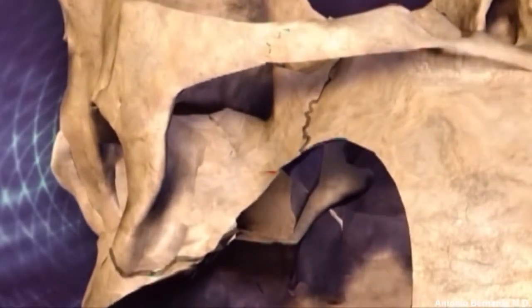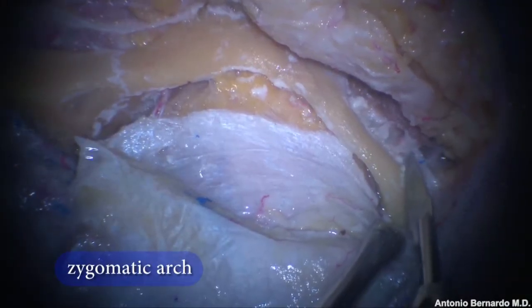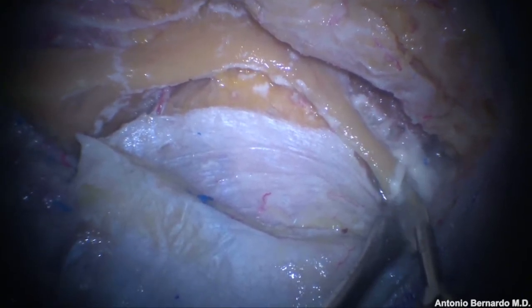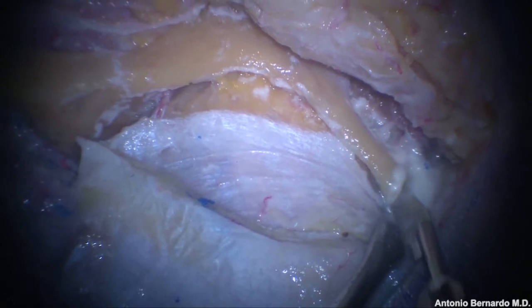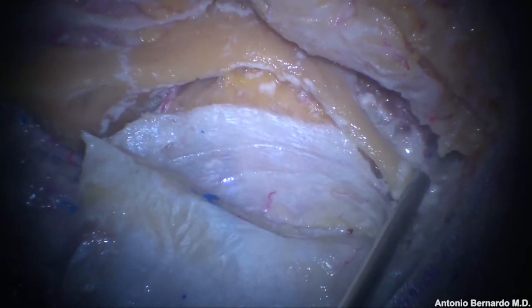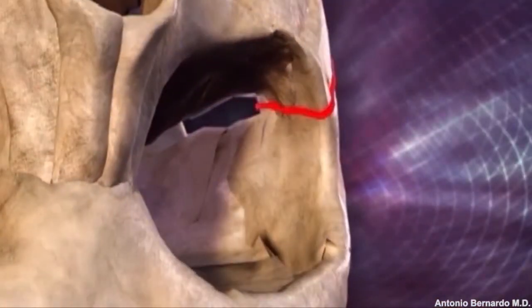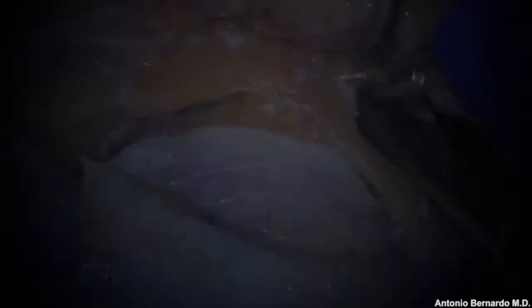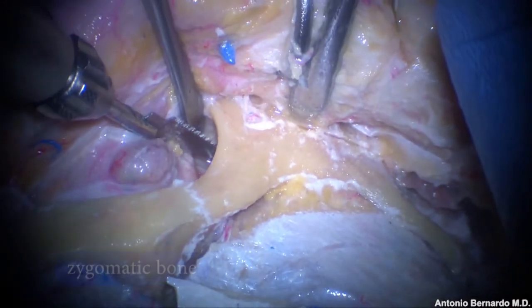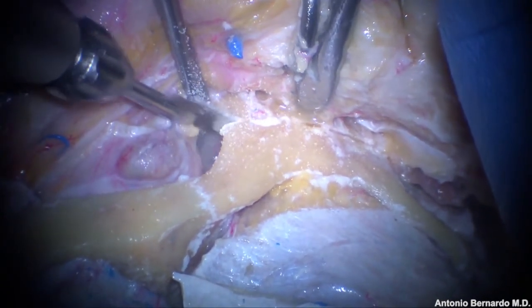After the periosteal flap is elevated, the first cut is made across the root of the zygomatic process. Extreme care should be taken to avoid violation of the temporomandibular joint capsule. The second and third cuts divide the zygomatic bone just above the level of the malar eminence. The inferior orbital fissure is identified and will be a guide for the placement of the reciprocating saw.